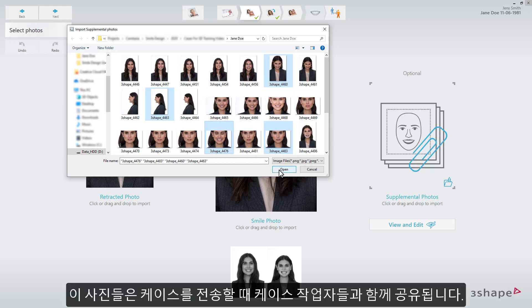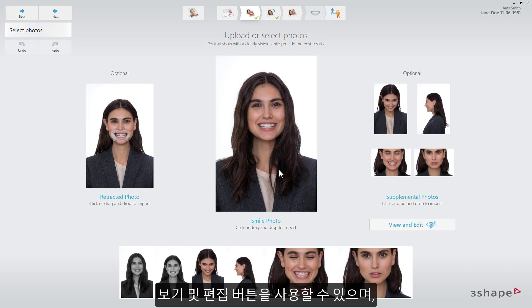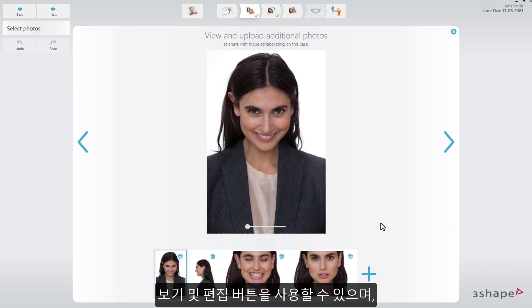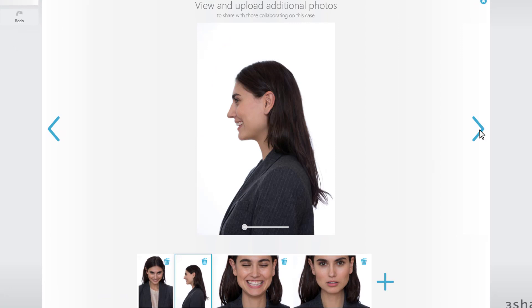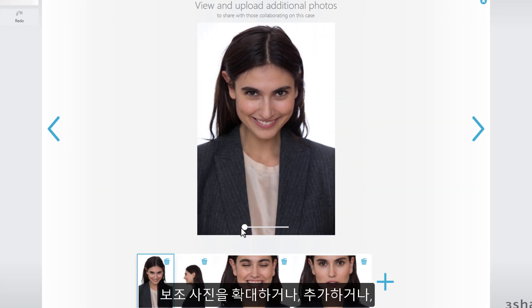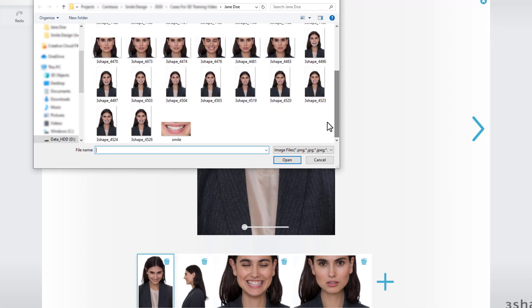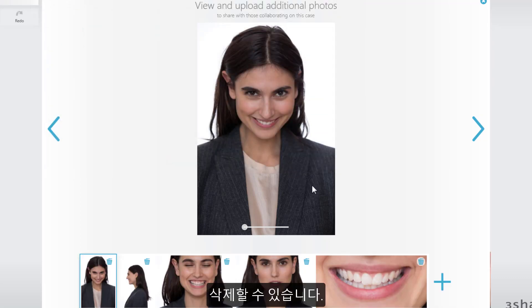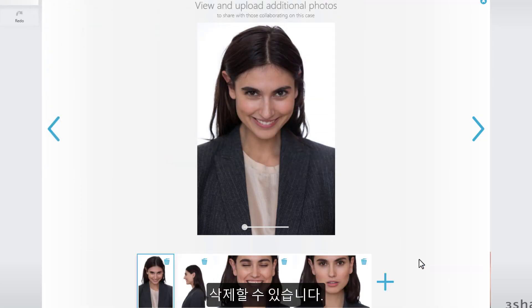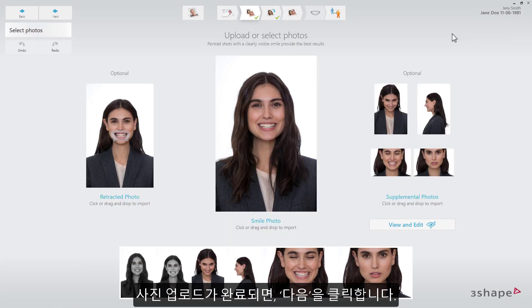These will be shared with your collaborators when sending the case. Use the View and Edit button to enlarge, add, or remove Supplemental Photos. When the photos are uploaded, press Next.